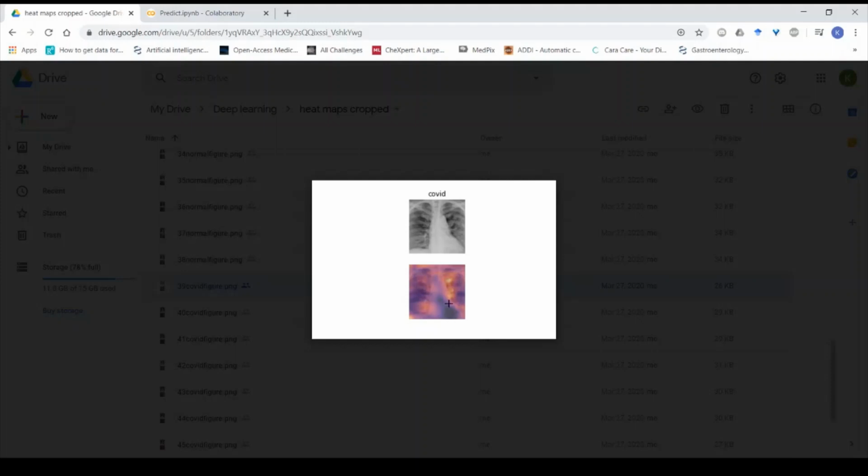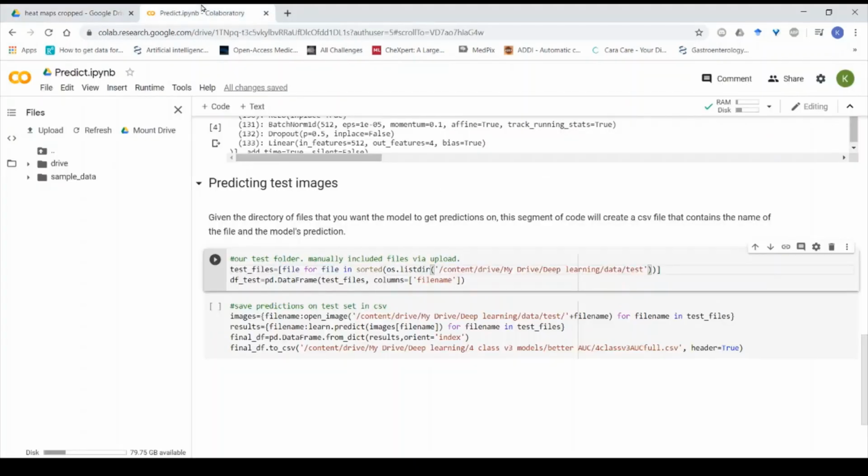This could be applicable for radiologists, as they can look for the regions that this network thought was really interesting, and maybe help them diagnose COVID-19 patients much easier. In all, this model stands as an awesome proof of concept in just how viable deep convolutional neural networks are in the field of radiology. I hope that you guys can continue building onto this project, and we can together work to fight against the COVID-19 pandemic.